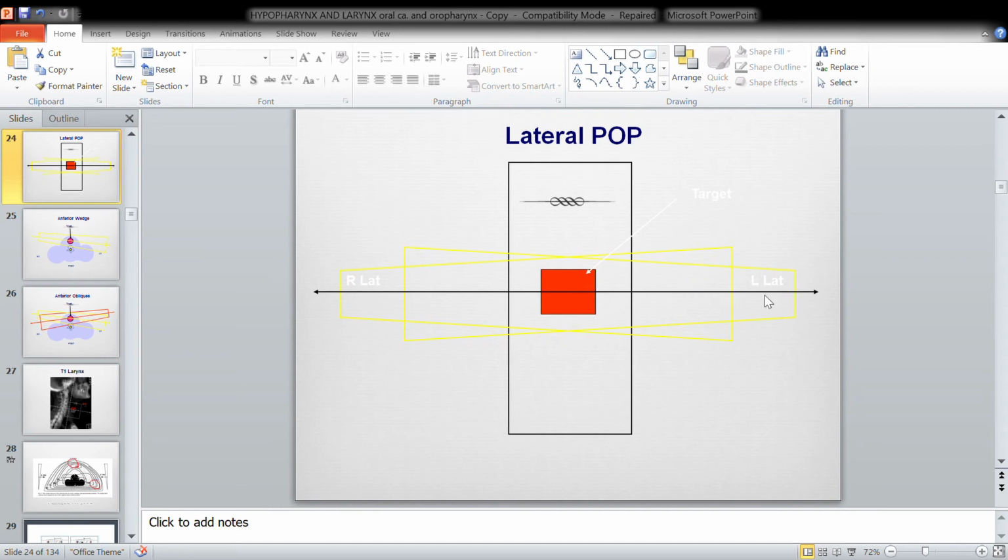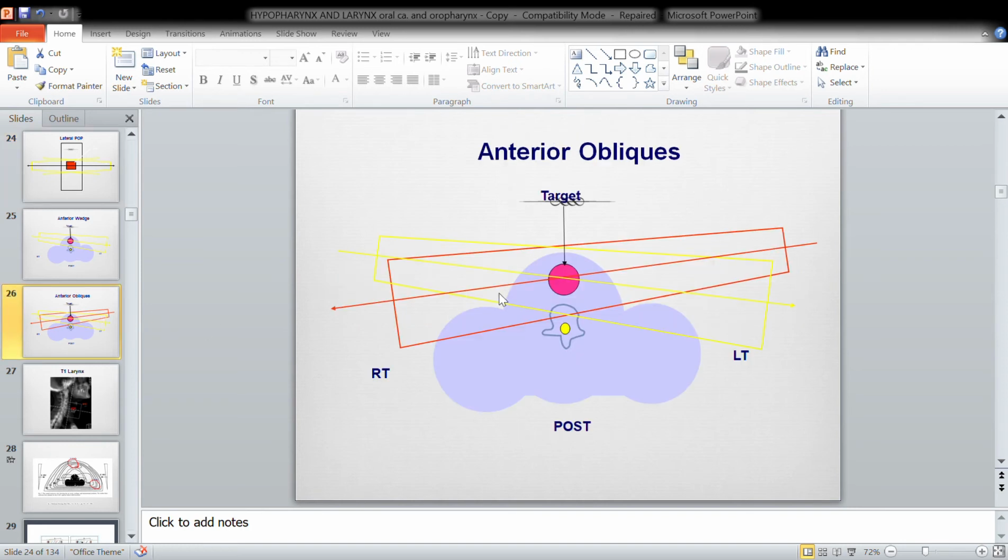So please don't irradiate your shoulder. I mean, first, you will not get a nice dose, and second, why would you irradiate the shoulder? You don't have to do that. What you can simply do is what they call inferior angulation. They call it inferior angulation because of the direction of the beam, as if the beam is directed upward. So this is one method: you can move the gantry up, and this will direct the beam down, and then you are staying away from the shoulder of the patient.